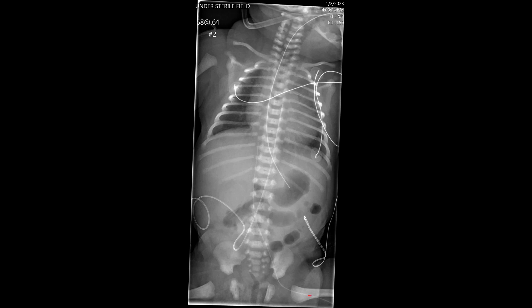This is the peripherally inserted central venous catheter coming from the left lower extremity into the common iliac vein to the confluence with the IVC. It courses up the right abdomen within the IVC, behind the liver, right to that cavoatrial junction. The inferior cavoatrial junction is presumed to be at the level of the diaphragm. We can see this faint catheter coursing up and terminating in the expected location at the inferior cavoatrial junction.